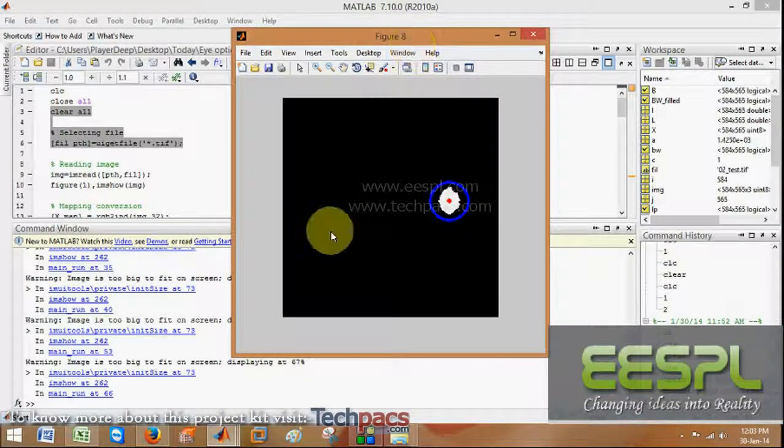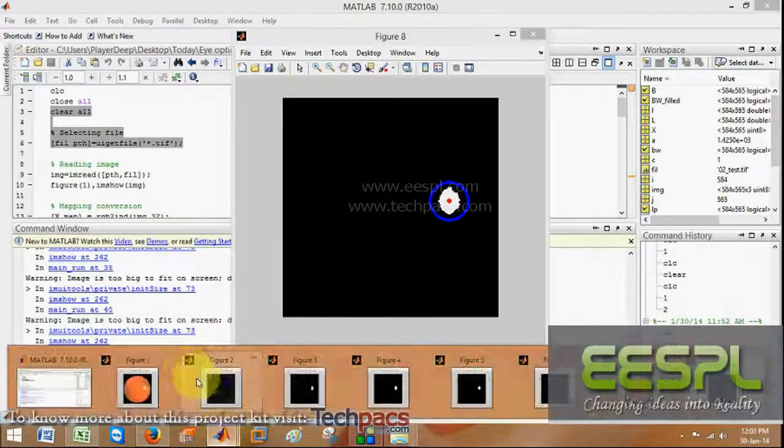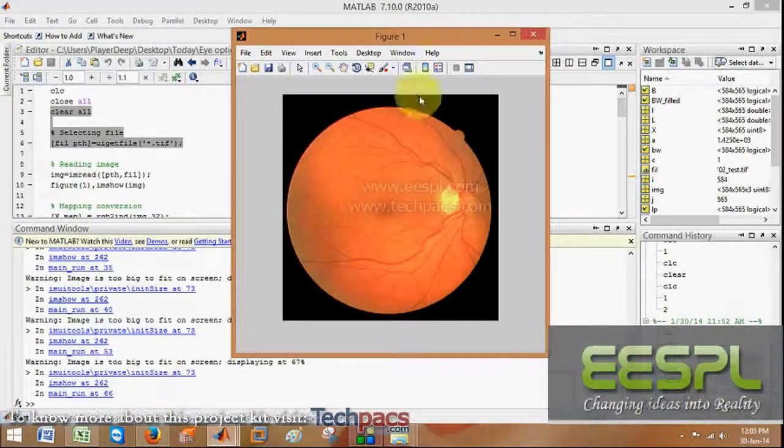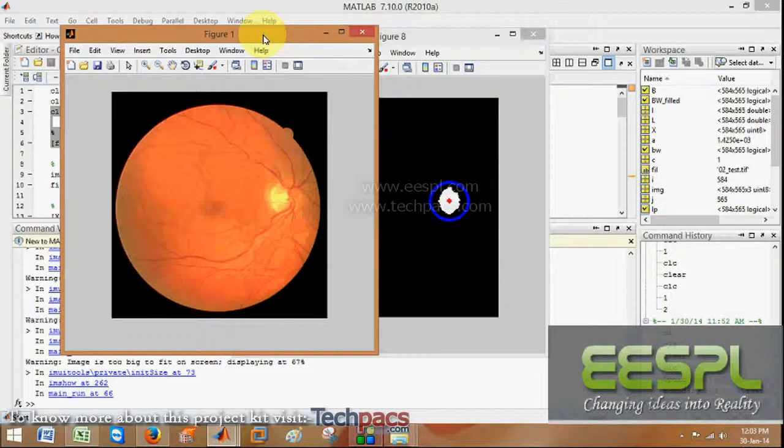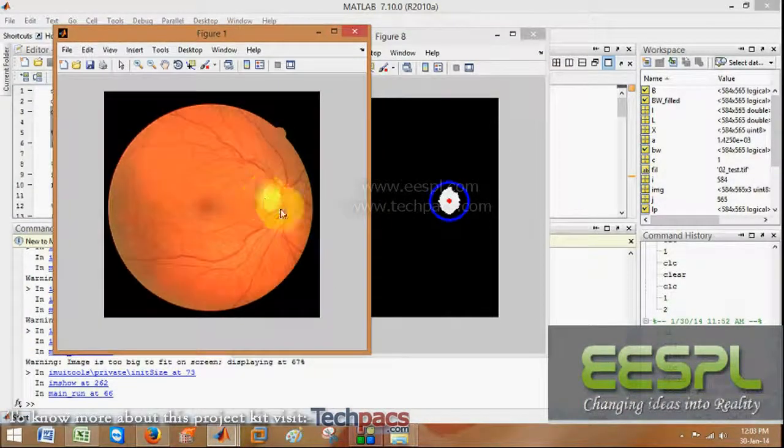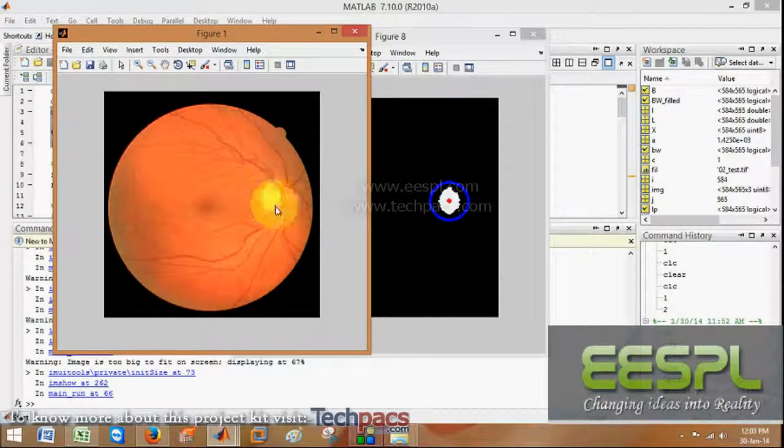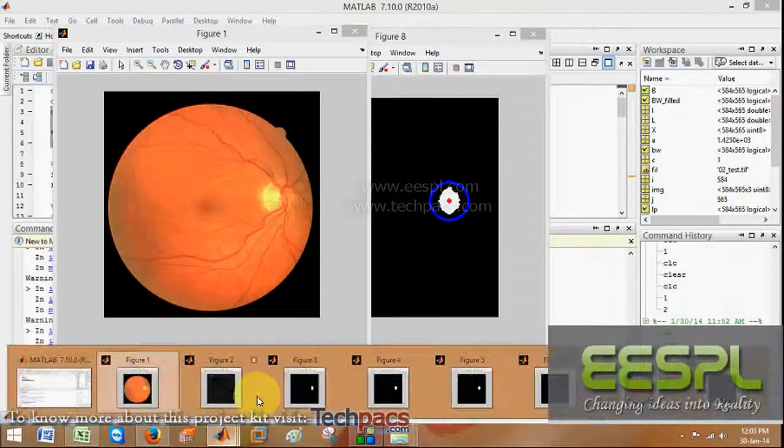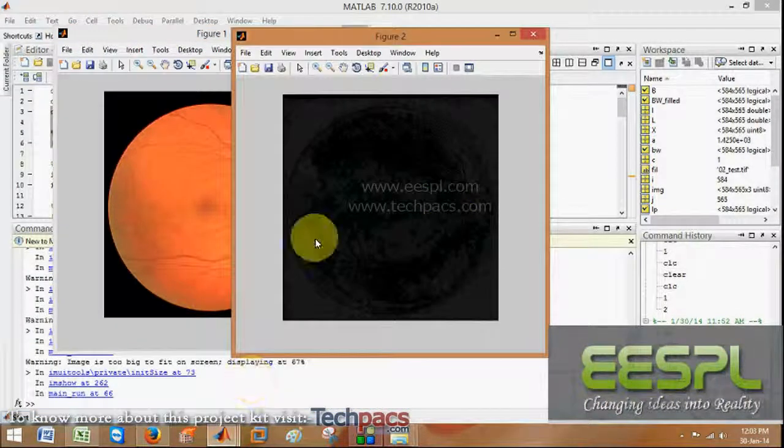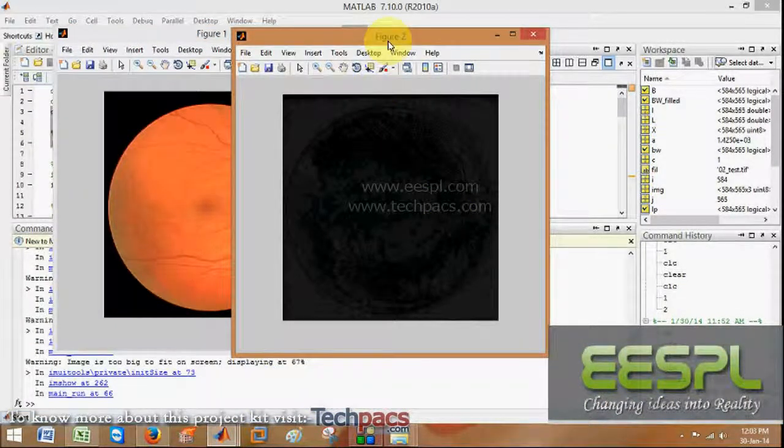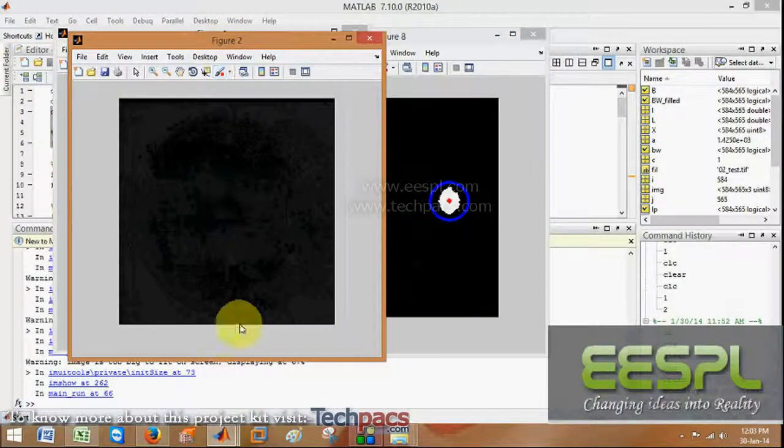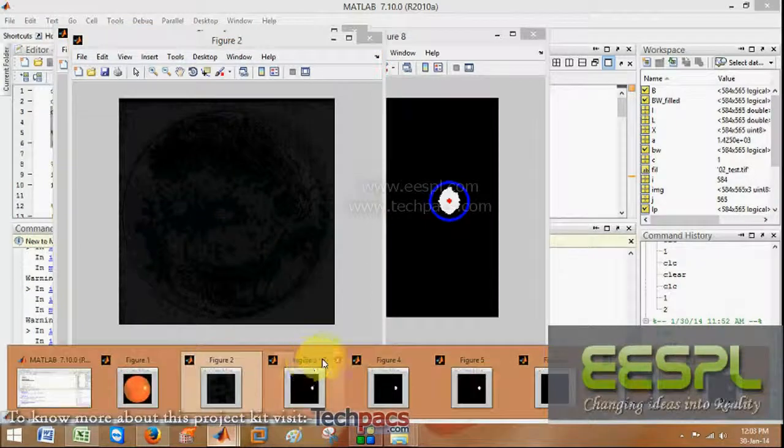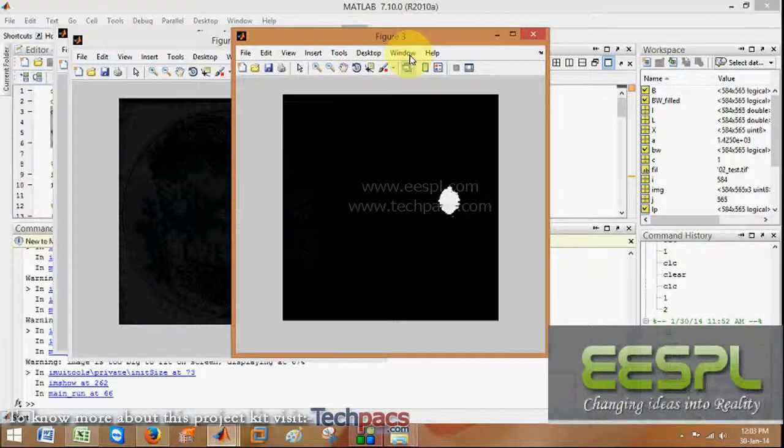Finally, the optic disc from the original image. This was the original image in which this is the optic disc which we have to detect. After this, the next step is generally to convert this to a particular form.